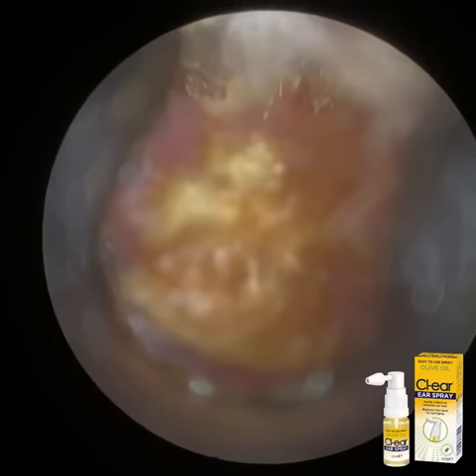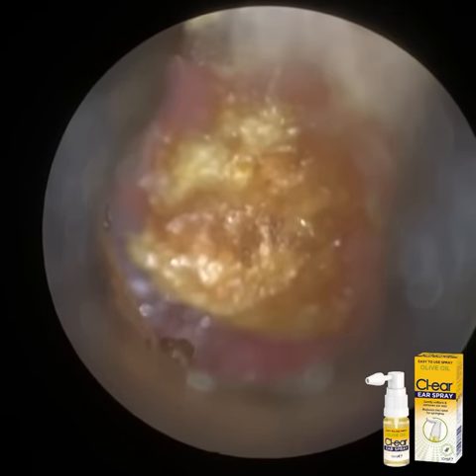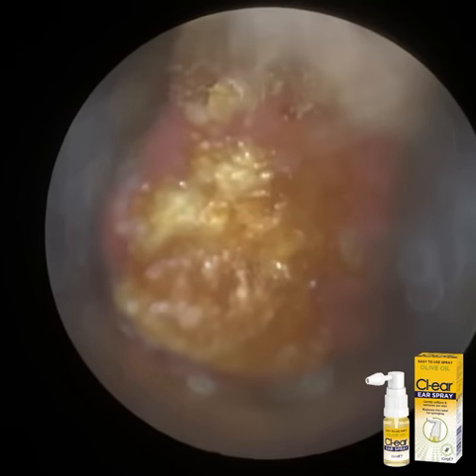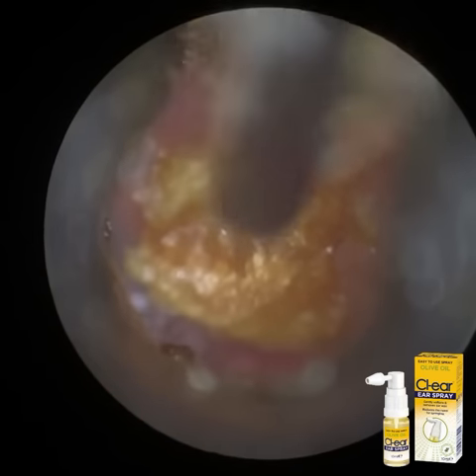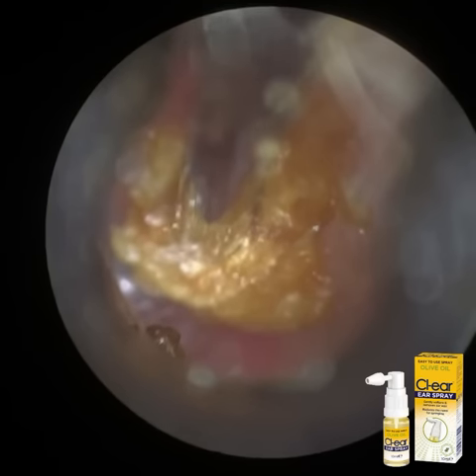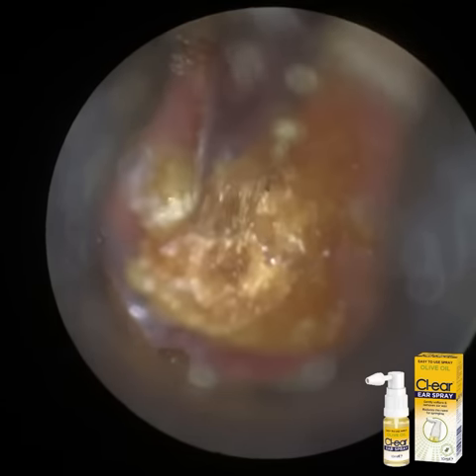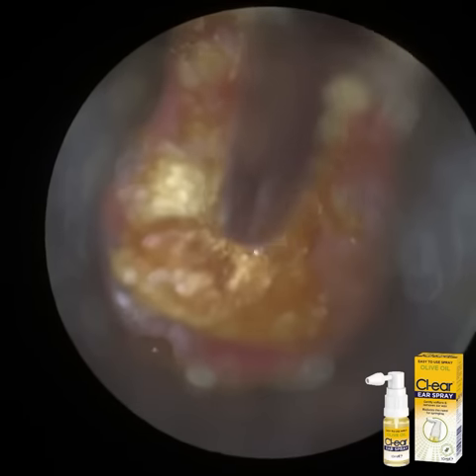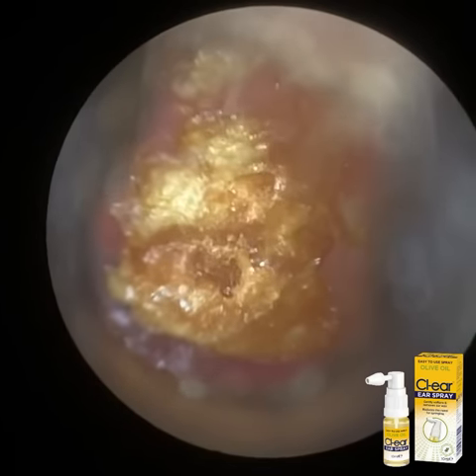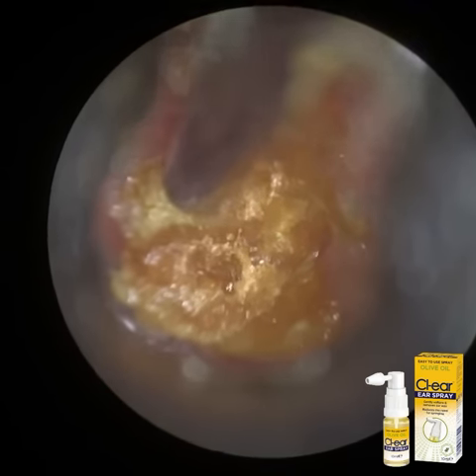You can compare motion parallax to, if you're in a car, for example, and you're looking out the window, whatever's in the distance, you're seeing at a slower rate, but directly outside, adjacent cars are going much faster. The difference in the rate of change of the image nearest to you and furthest away from you helps your brain develop depth perception. It's similar in the ear. When you're putting the instrument in, you're seeing it relative to other aspects of the ear, so that can give you depth perception. And also shadows, and when you know your landmarks.